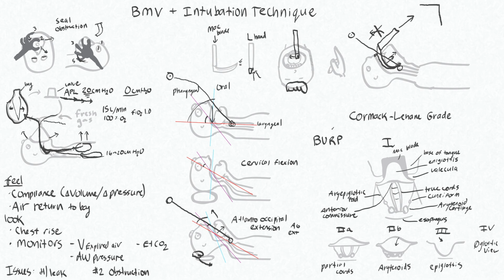So before you grab your endotracheal tube from your assistant, you'll decide if you like your view or if instead you're going to manipulate the neck. So the backward pressure is over top of the thyroid cartilage on this patient. So back, you'll push down on that. And hopefully by doing that, you will displace the glottis below what is obstructing it here.